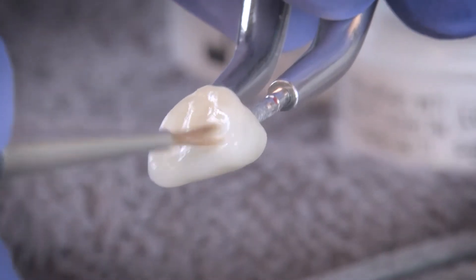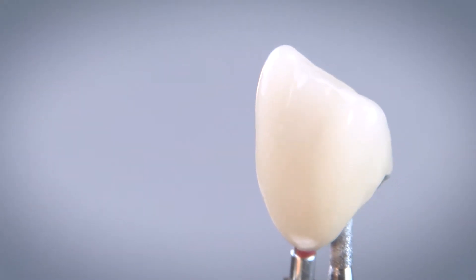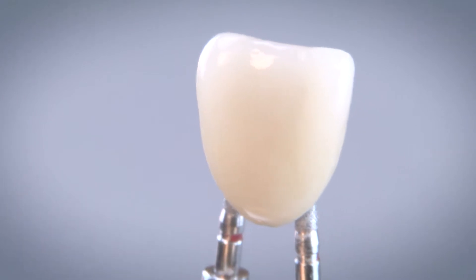Edwin Zanabria, a second-generation lab technician, knows that reproducing a natural tooth can be extraordinarily difficult. When basic technique is not enough to create a complementary fit, finish, and overall restoration, a good technician must also be an artist.